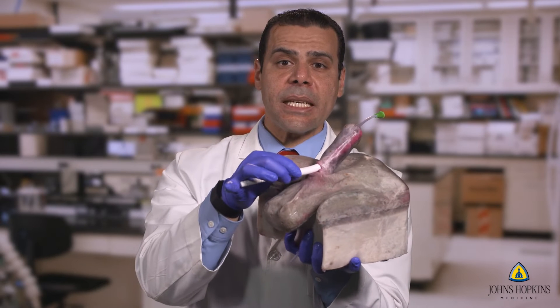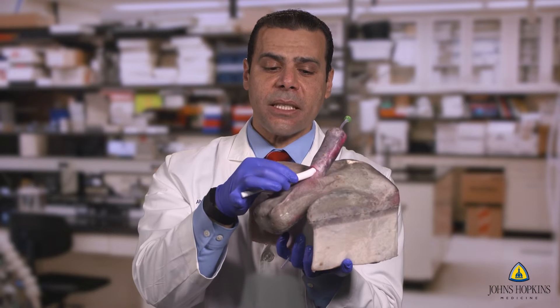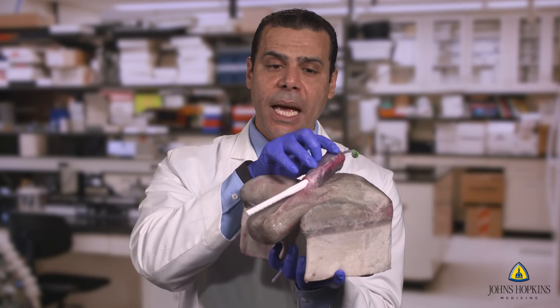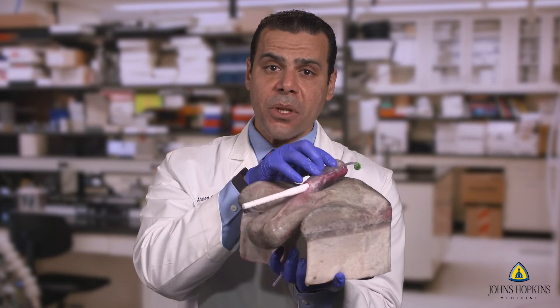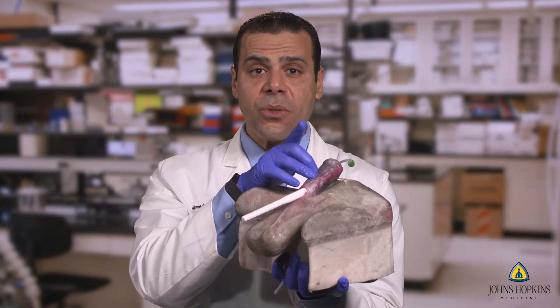Here you can see that we were able to create an actual corpora that enables a prosthesis to be inserted. You're able to actually feel it, but if you apply too aggressive a dilatation, this will perforate, as you will see in the video.